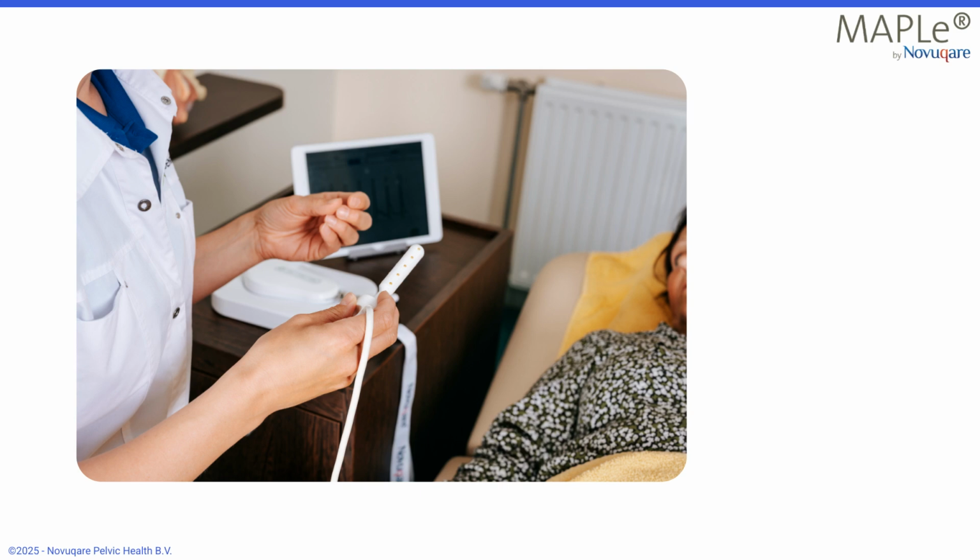Possible reasons for ineffective ES. If ES does not produce a sensory response or muscle contraction, possible causes include too low current intensity, incorrect electrode placement, suboptimal stimulation settings, insufficient, excessive, or unsuitable conductive gel, underlying nerve damage.